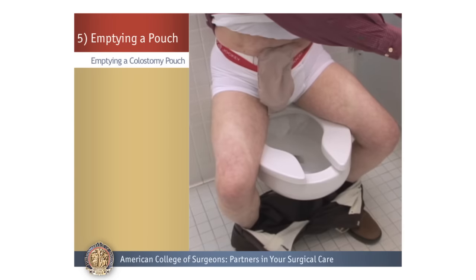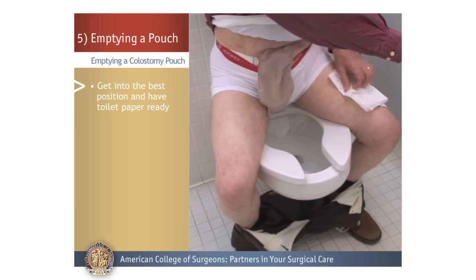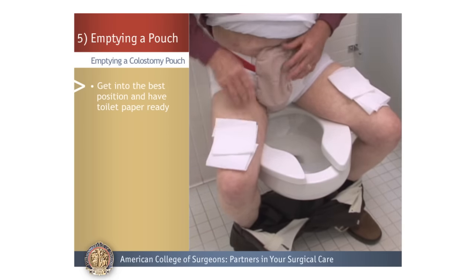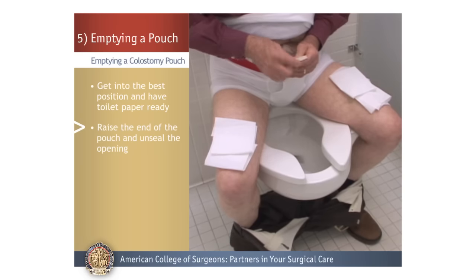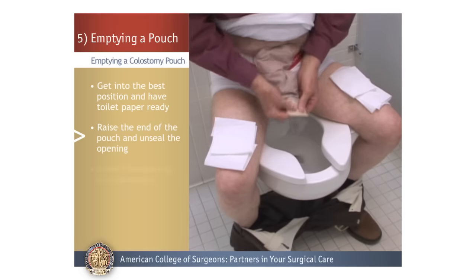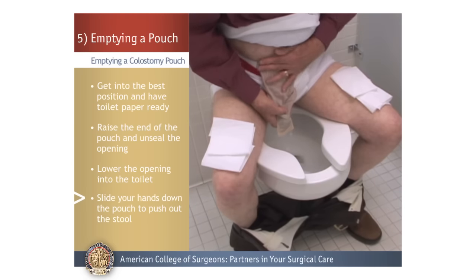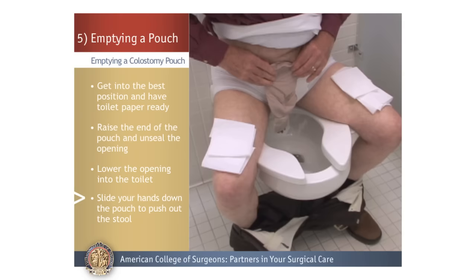To empty stool from the pouch, get into the best position for you and have toilet paper ready. Next, raise the end of the pouch and unseal the pouch opening. Lower the opening into the toilet. Slide your hands down the pouch to push out the stool.